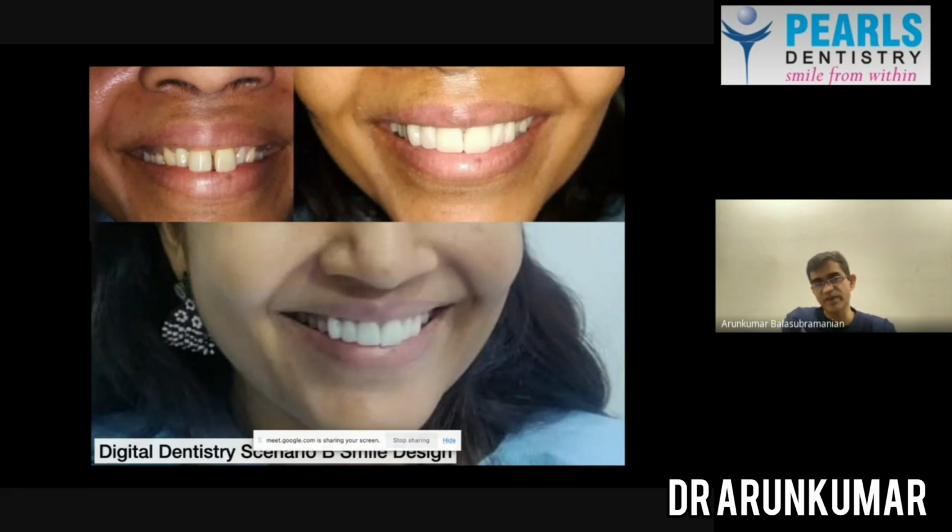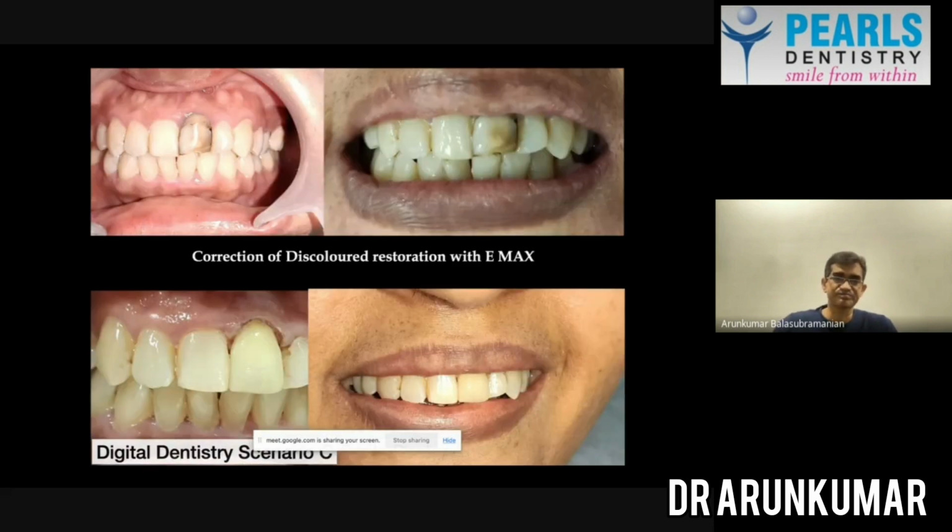So this is a case where we have done a smile design. All the patient's teeth were not in one alignment. There was a lot of proclination of the teeth. There were gaps. The teeth were not all aligned. So we can use digital dentistry to do what is called a smile design. How we go about doing the smile design will be further discussed as we go through the presentation.